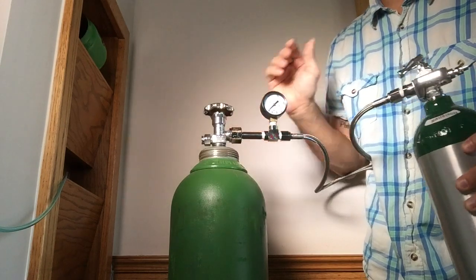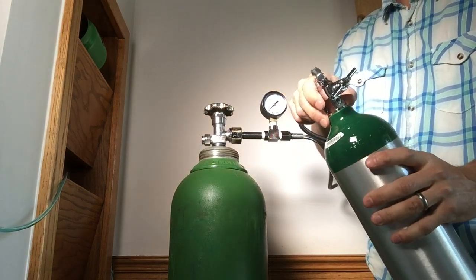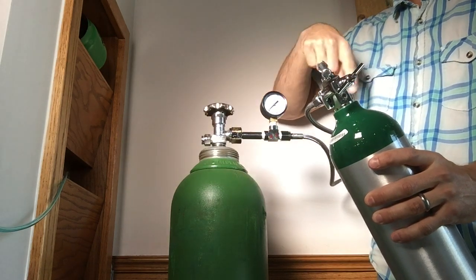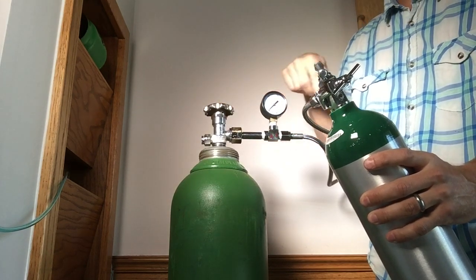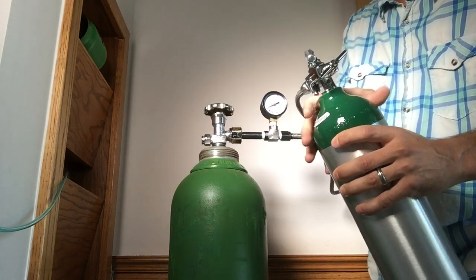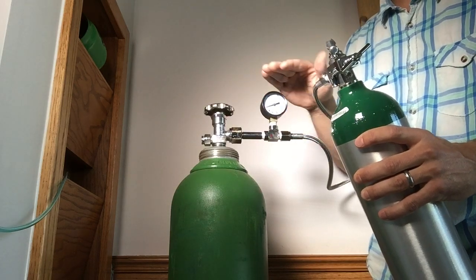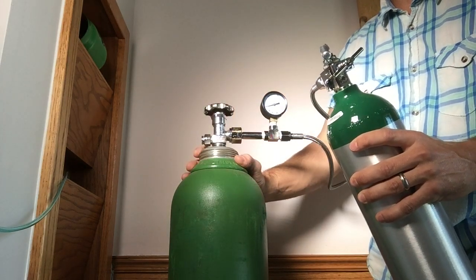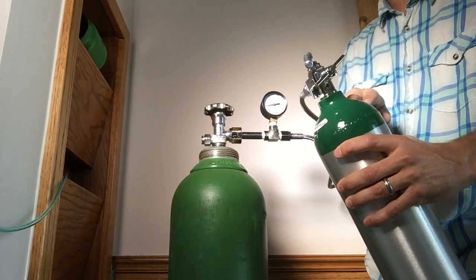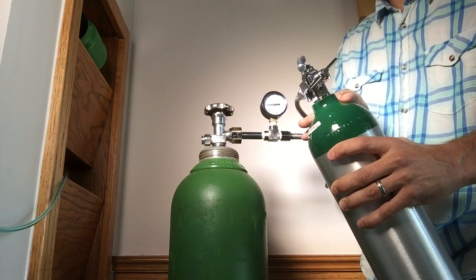Now I'm ready to fill the tank — it's connected securely on both sides. I'm going to make sure the valve is open on the top of the small tank I'm filling. Then I'll slowly open the valve on my larger fill tank and I can hear the oxygen transferring. I'll allow that process to continue. Once the smaller tank is full, you'll hear the hissing stop and see the needle stop. The pressure will equalize — so if I have 1000 or 1500 psi in the larger tank, I'll have 1000 or 1500 psi in the smaller tank when done.